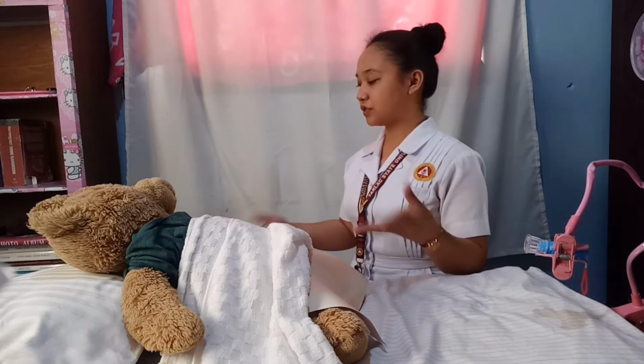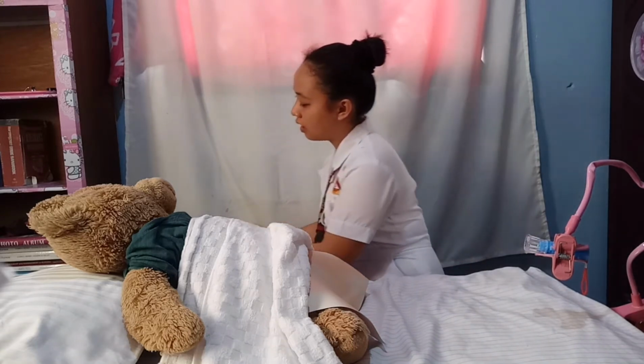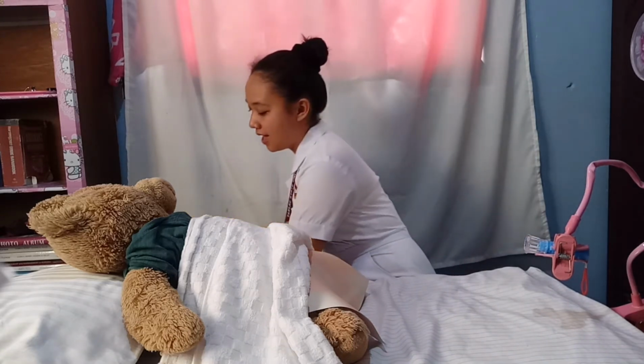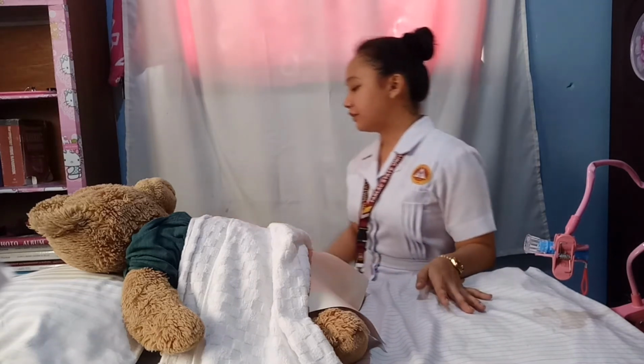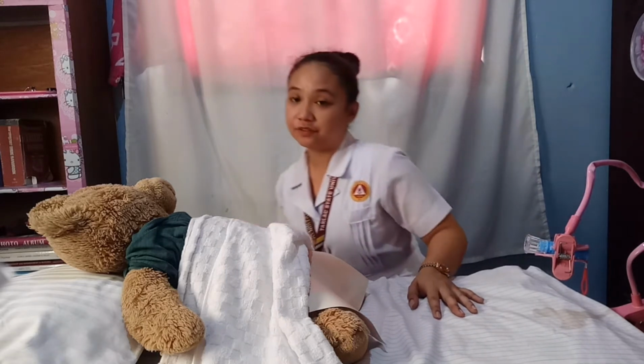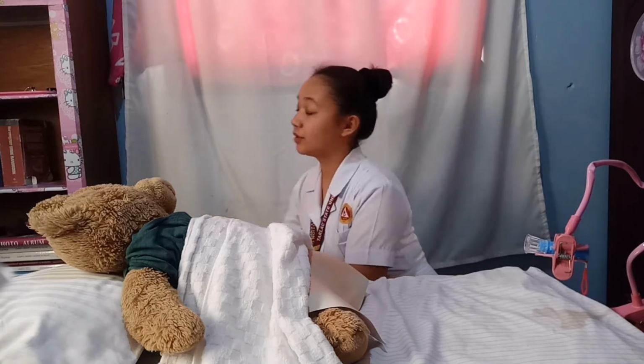For that, we first need to assemble all the equipment that we need. We have here the sterile catheterization kit, and we also have the other materials for the perineal flushing set. Now we need to perform hand hygiene. The next thing you need to do is explain to the client what you're going to do, the procedure, and also the purposes of what you are going to do.